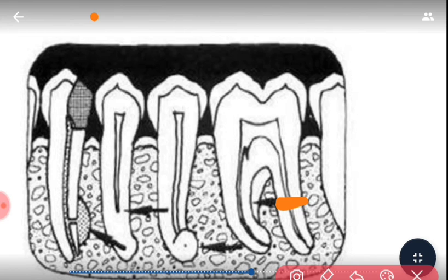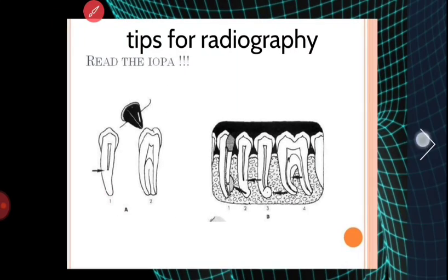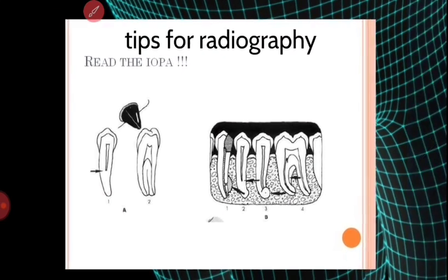Which doesn't end into the pulp chamber, it's not a canal. Basically it's double lamina dura, the shadow of the lamina dura. So if you suspect that there is another canal, before you start digging the tooth, see whether that line on the x-ray is ending where it should or not. It should end in the chamber, then only it's a canal. Otherwise it's an image of the lamina dura.